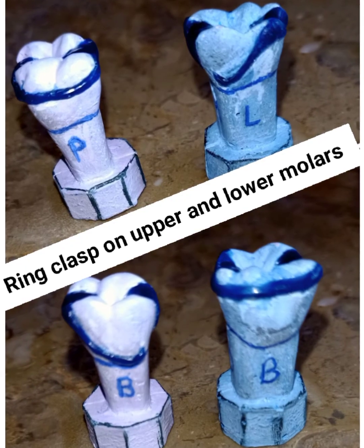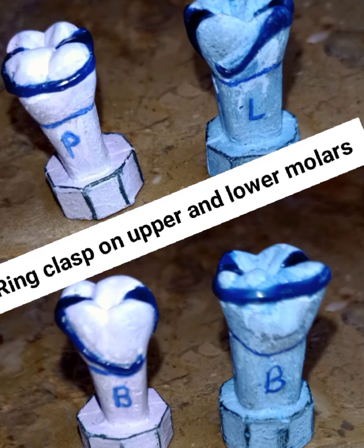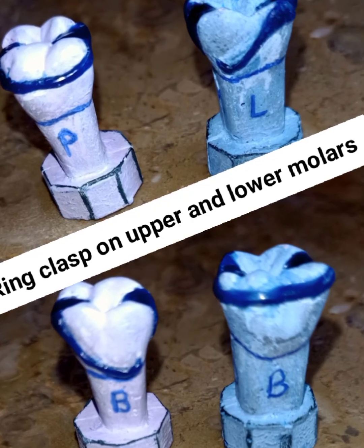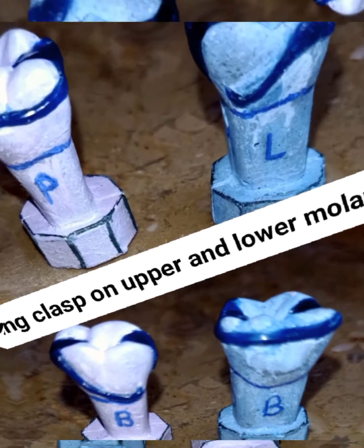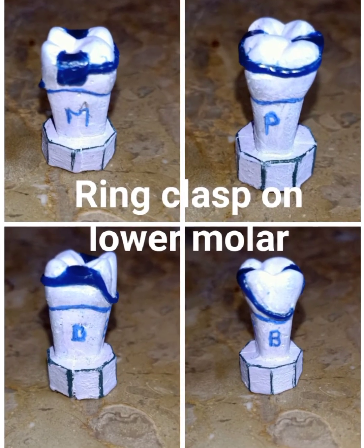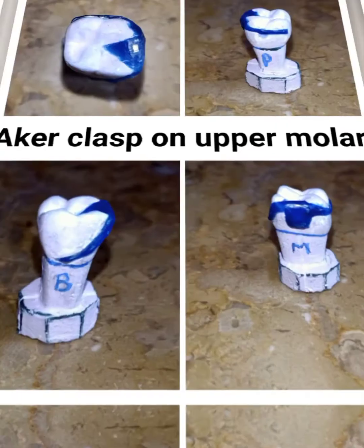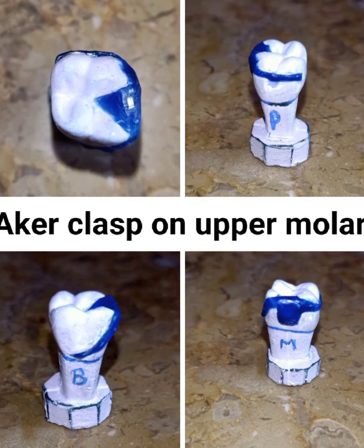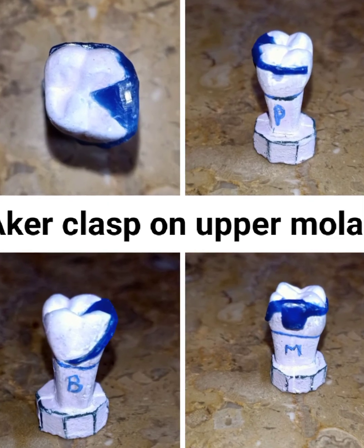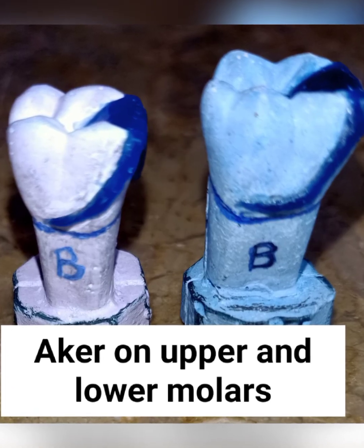You are going to make one upper tooth and one lower tooth ring clasp because they are different, and you have to make one Akers clasp either on the upper or on the lower, because Akers is the same on upper molars and lower molars: mesial occlusal rest, retentive arm on the buccal, and the bracing arm on the palatal or lingual surface. Thank you.